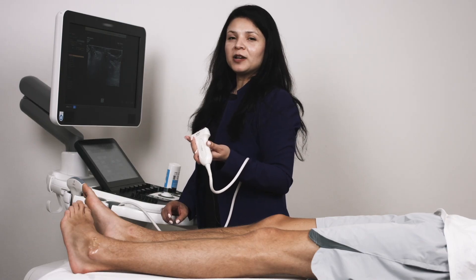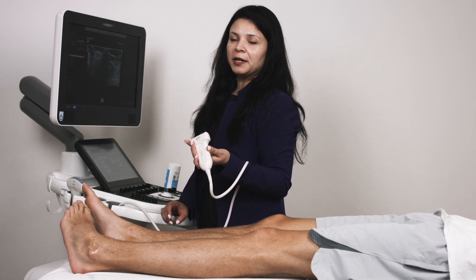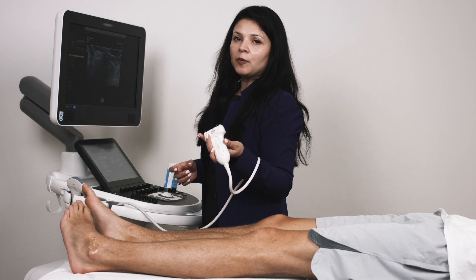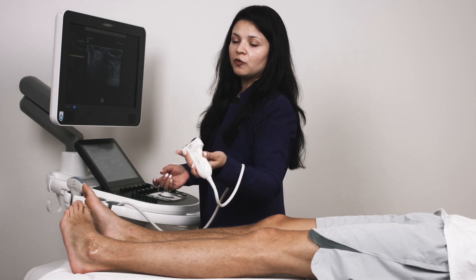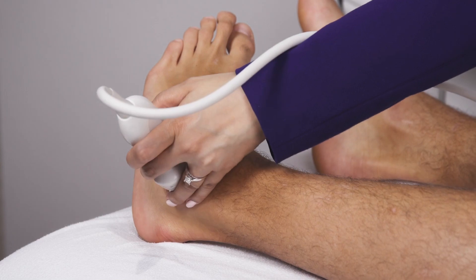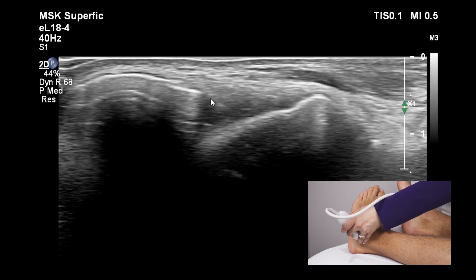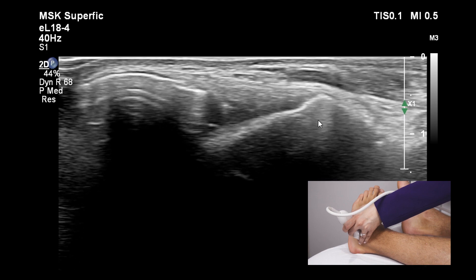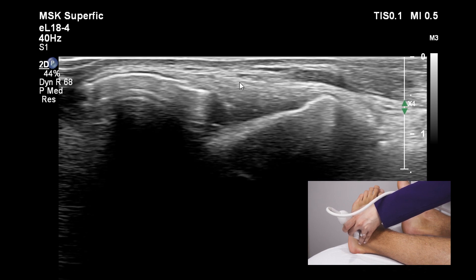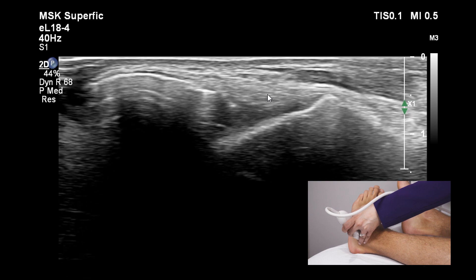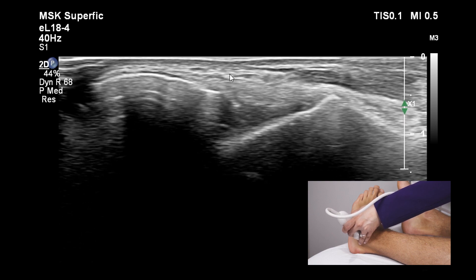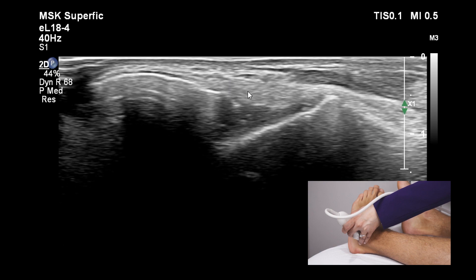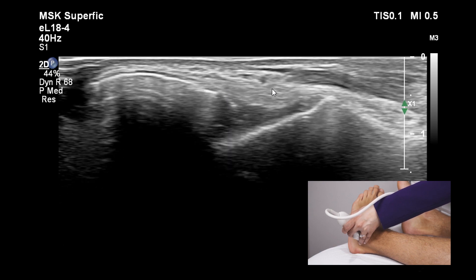Let's look at the longitudinal image of the anterior talofibular ligament. To obtain that image, we need to bridge the lateral malleolus with the talus. Placing the probe and looking at the two bony landmarks — on the left is the lateral malleolus or fibula, on the right is the talus. Between the two bones, you can see a hyperechoic fibrillar structure extending between the two bony interfaces. This structure is the anterior talofibular ligament.